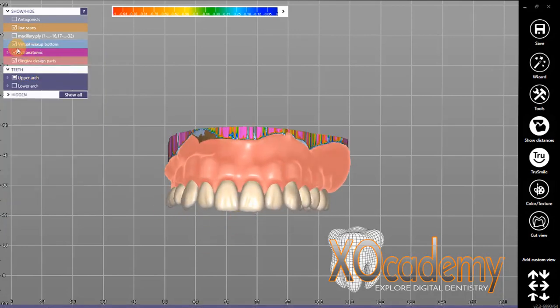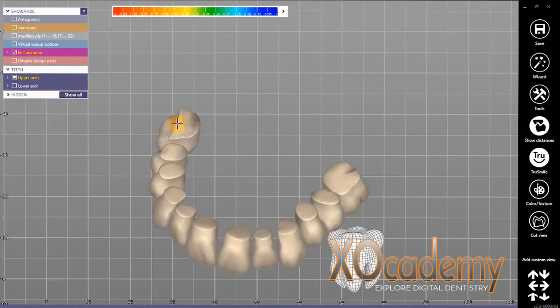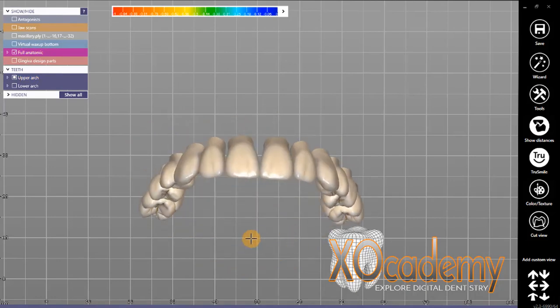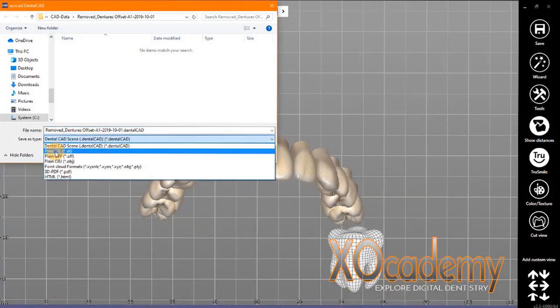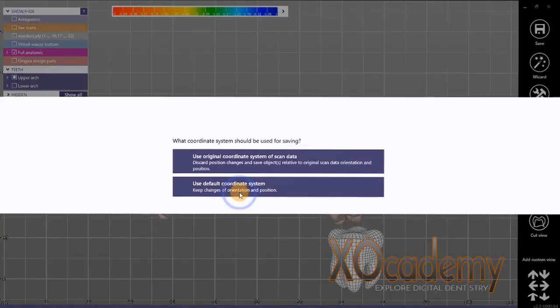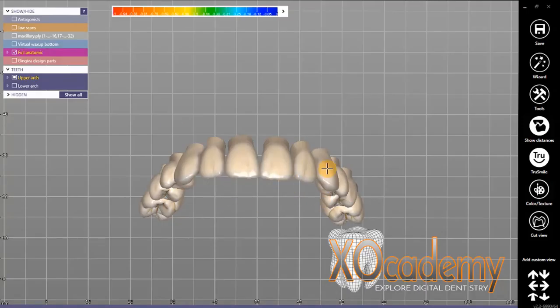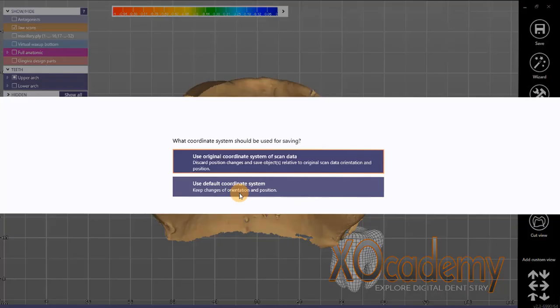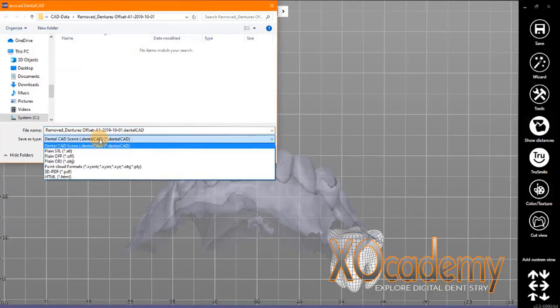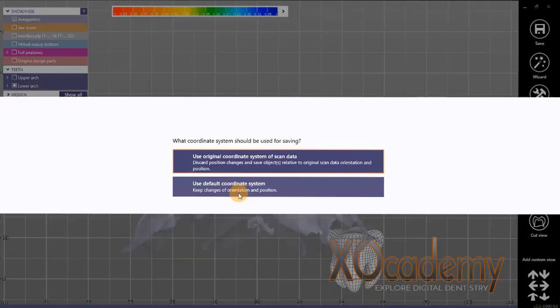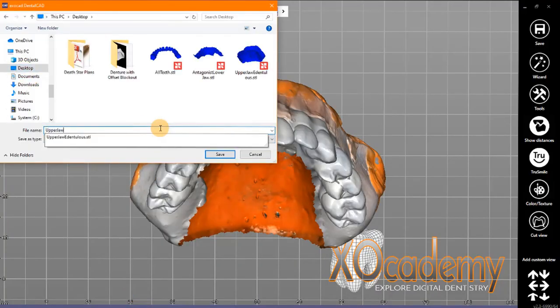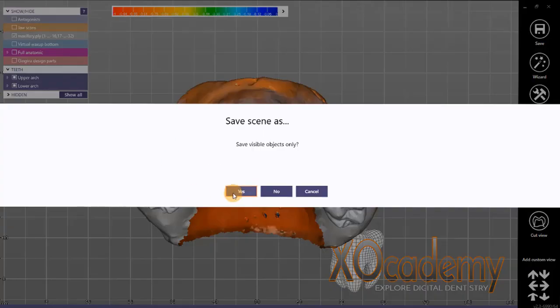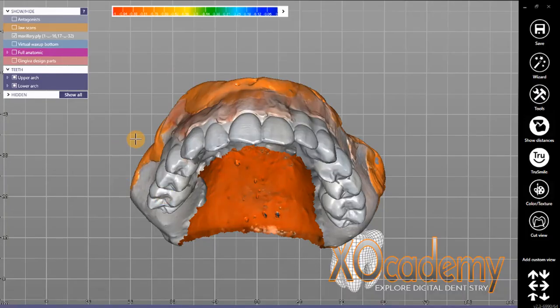If we want to separate the teeth, there are a couple more steps. In the ExoCAD Denture module it will automatically produce an offset, automatically separate the teeth, and automatically give us a denture base with tooth pockets. But if we're just using the base ExoCAD basic module, we're going to have to come up with those surfaces and designs independently ourselves.